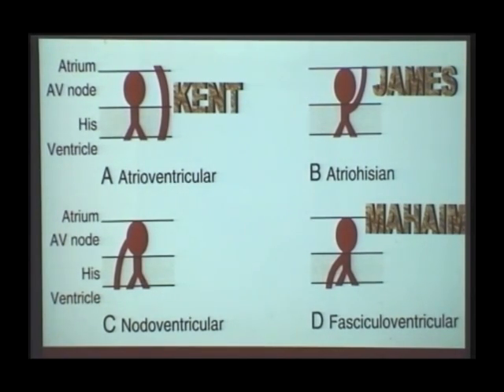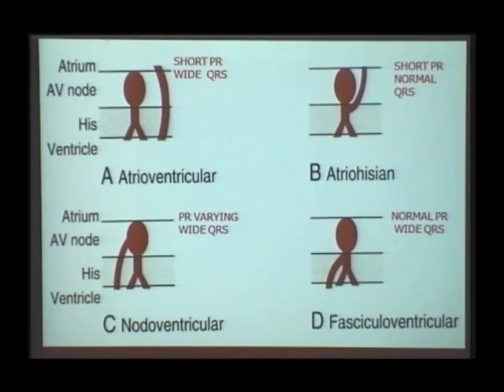So whenever I have a short PR interval and an initial slur in my QRS, I know it is an atrioventricular accessory pathway, which I call WPW pattern. I have a short PR because my AV node is bypassed, and subsequent conduction through the muscle produces the initial widening of the QRS. So: short PR, initial slur called delta wave, terminal sharp QRS complex. Whenever PR is short with a delta wave, it is a Kent pathway.